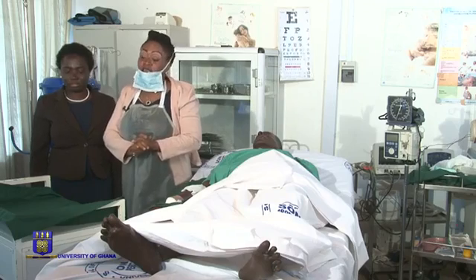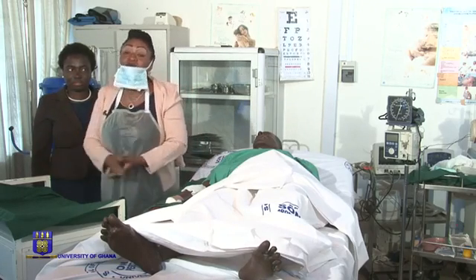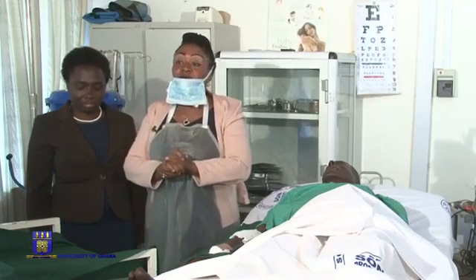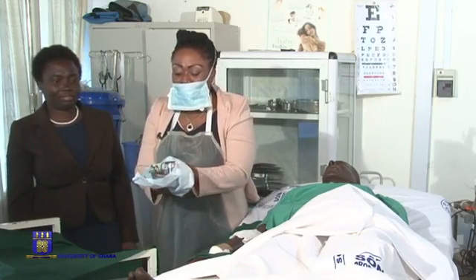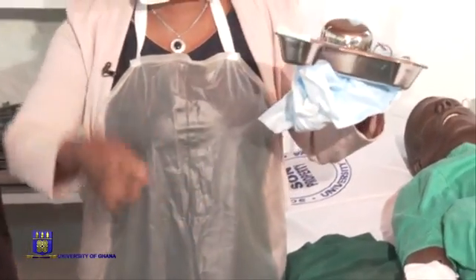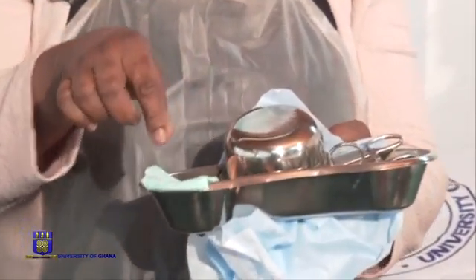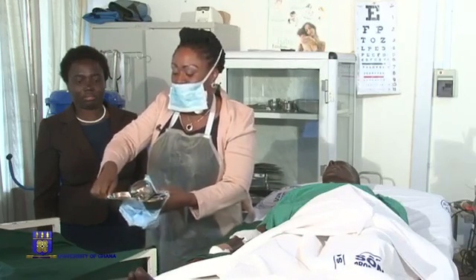Now the procedure. We have a sterile field protected with a sterile dressing towel. So it's time to set up the sterile field. These instruments are sterile, and therefore our hands are not supposed to touch them. But we have a sterile piece of paper inside the instruments which can be used in touching the gallipots and the receivers.